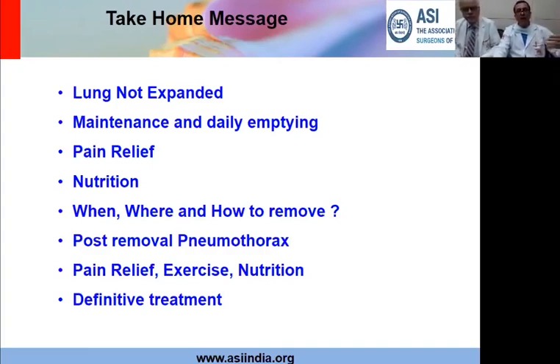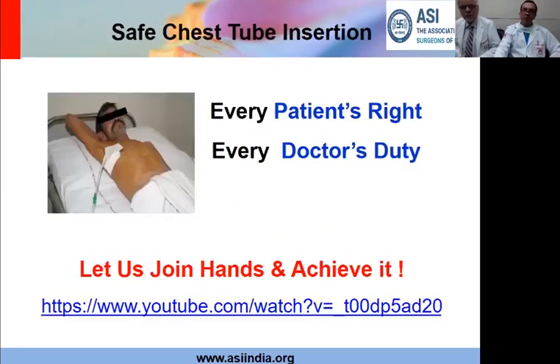Now, when, where, and how to remove the chest tube, we have discussed it. Please follow these principles, but always look out for post-removal pneumothorax and act. If the patient is comfortable, wait, otherwise reinsert the chest tube. Pain relief is important, exercise is important, nutrition is important, but of course, chest tube insertion is just one part of management. If the patient has some other problem, definitive treatment for that problem is also equally important.